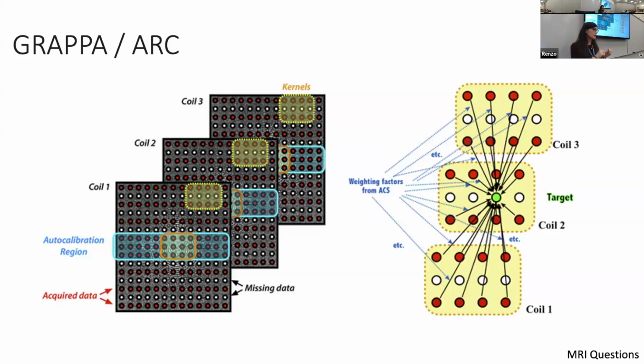So it tries to skip over having to do a reconstruction prior to solving the problem of getting the voxel values. And so what we're going to do here, you can see in this little toy example again, let's say we're recording all of these red voxels in k-space, and we're skipping lines here.